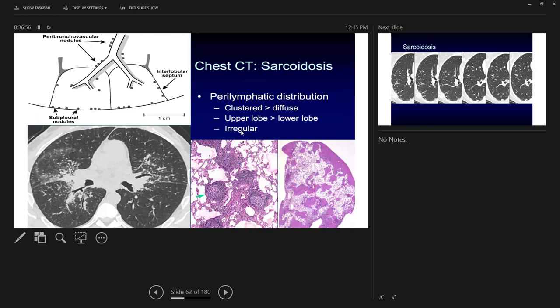In sarcoidosis, the CT findings include mediastinal adenopathy, nodules along the fissure and interlobular septum, and pleural involvement. The pathology description on board questions will include non-caseating granulomas. They may provide a pathology description without a CT scan, and you must arrive at the diagnosis. If the question mentions small nodules along the bronchovascular bundle with mediastinal adenopathy and pathology showing non-caseating granuloma, the diagnosis is sarcoidosis.